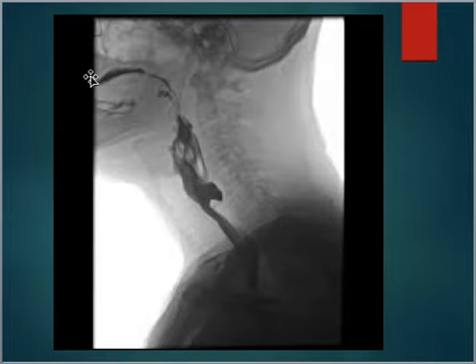This is kind of what the image looks like. These are usually live images. I know this is a still, but you can see the mouth moving, you can see him chewing and swallowing it down.